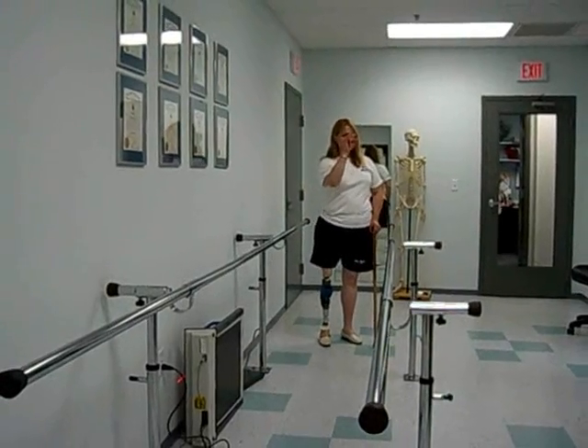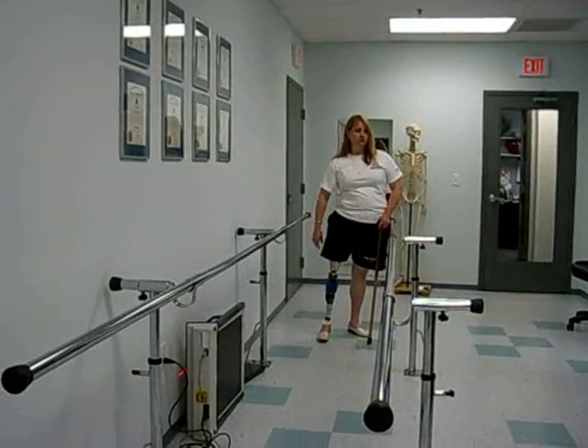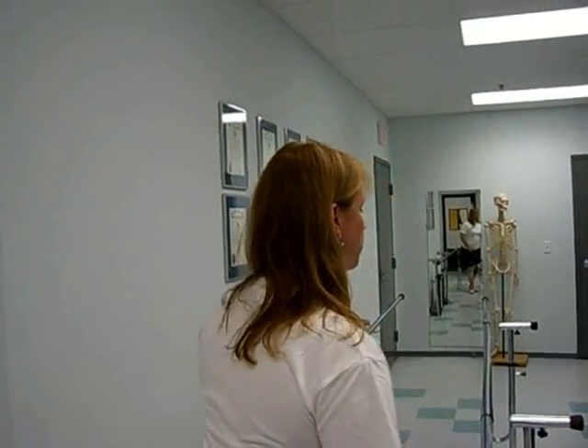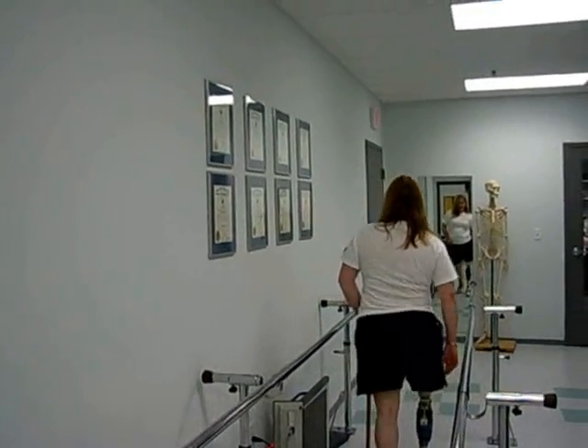I feel like the bottom of my stump is working harder than it usually does. Would that happen? You're still trying to push back high — don't. Yeah, you want to relax. I don't want you to stress. I want you to just walk like you're half asleep. You don't care. Just let it go.